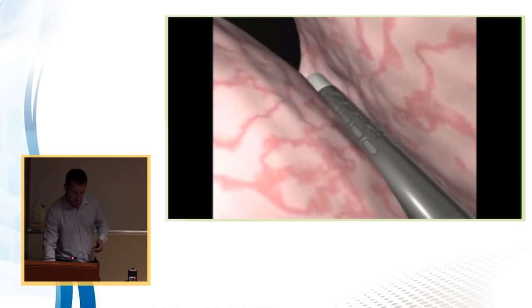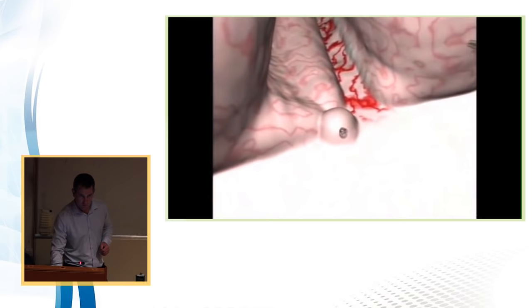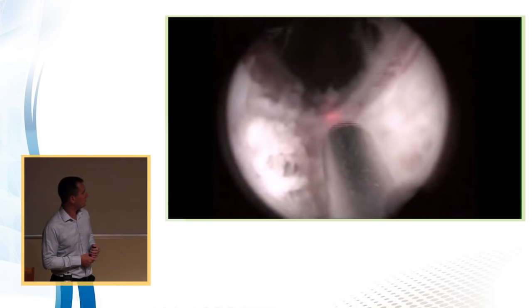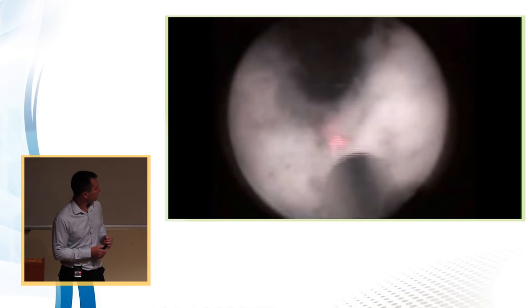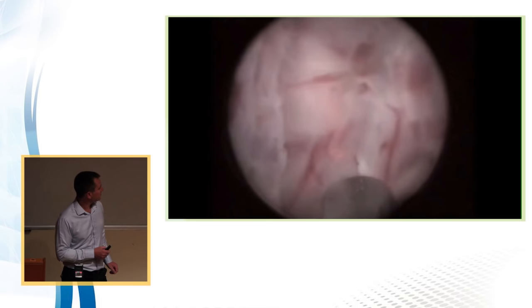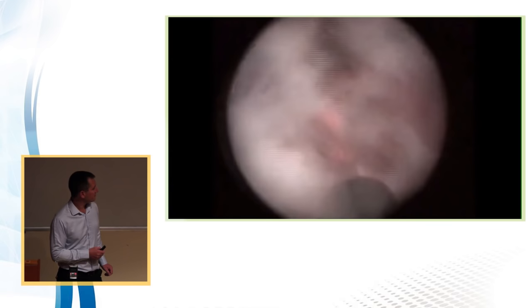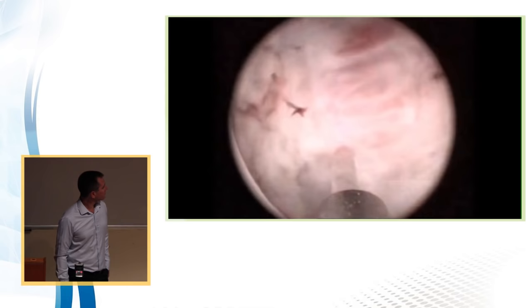This is the demonstration. The incision depth is increased until all circular fibers have been divided in order to identify the surgical capsule of the prostate. Identification of this plane is very important, as it is the cleavage plane along which the whole adenoma is shelled out. The incisions are then lengthened down just adjacent to the verumontanum.